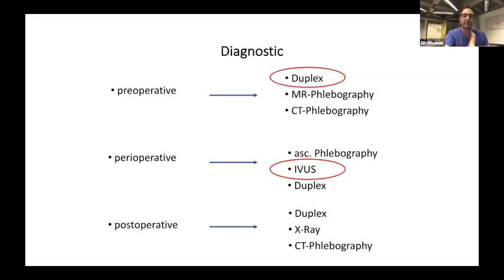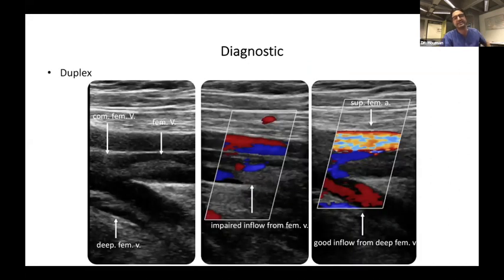If there are some further questions, then you can combine it with X-ray or CT phlebogram. So this is an example of duplex done by Erwin Thunder, our really brilliant duplexer and technician who works with us in Maastricht and Aachen. You see the groin, this is the left groin. You see the femoral vein as one main inflow vein. You see the deep femoral vein as the other main inflow vein. And you see the post-thrombotic trabeculation in both.